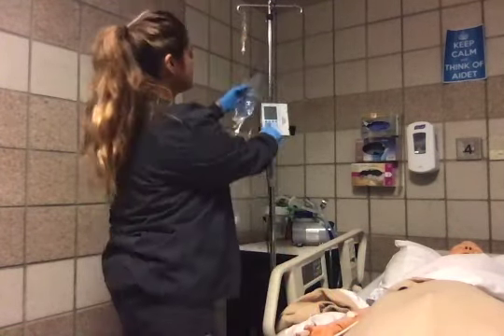And then I will stay with my patient a few more minutes, and I will teach him about any side effects. If he feels like his throat is closing, or if he has any redness at the IV site, then I'm going to have him use the call light as soon as possible and let me know what his reactions are.